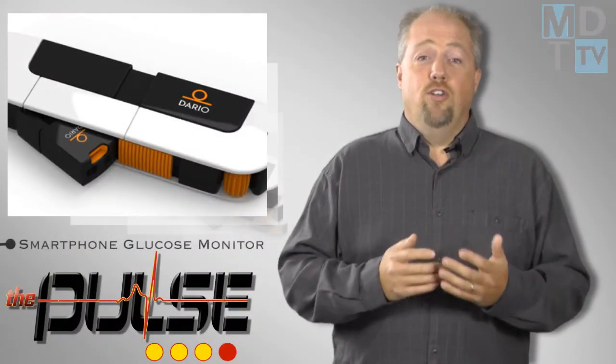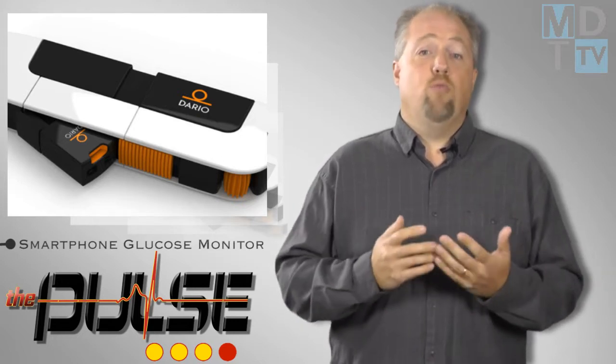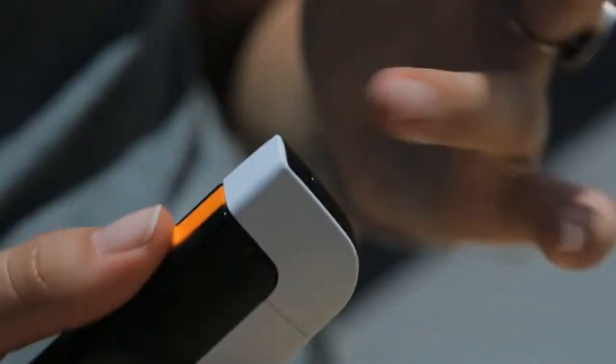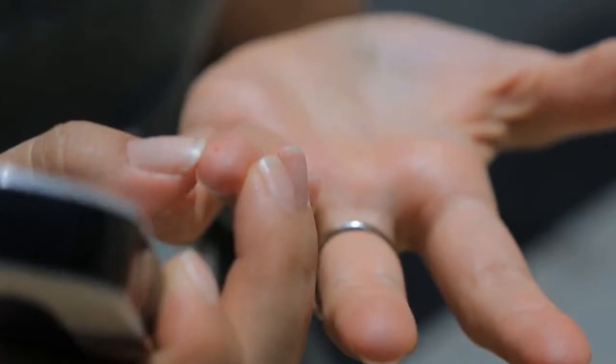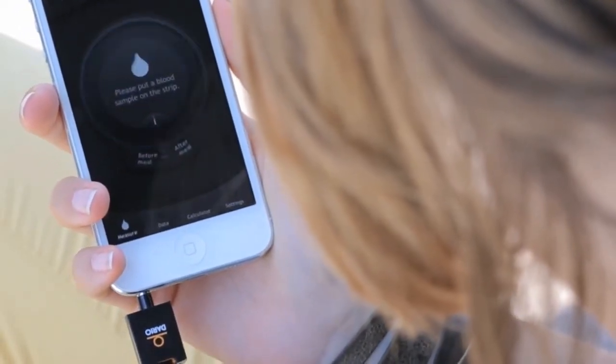LabStyle Innovations has a new compact glucose meter that pairs with a smartphone to display readings and maintain a historical record of the patient's blood sugar. The Dario Glucometer, which plugs into the phone's audio jack, comes with 25 test strips and a built-in lancet.